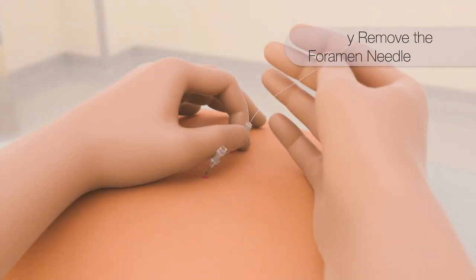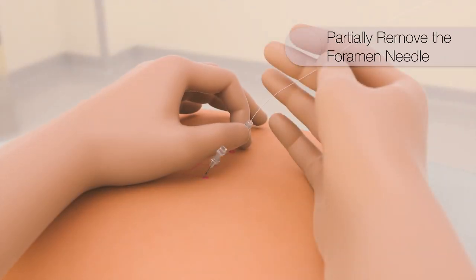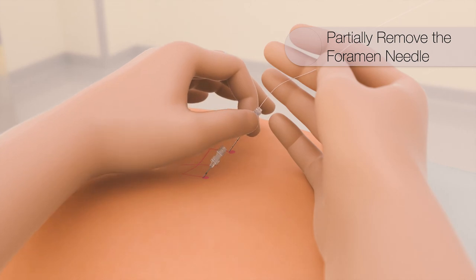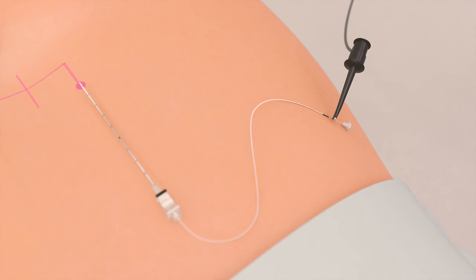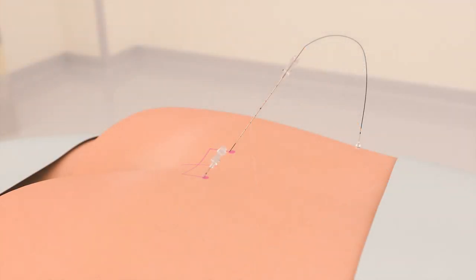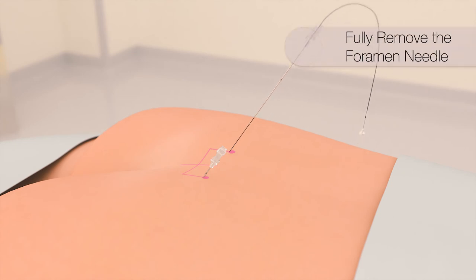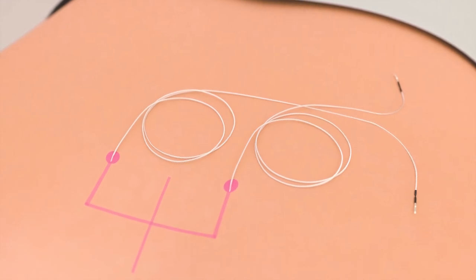The PNE lead is stabilized with one hand while removing the foramen needle from the skin with the other. Before it is fully removed, confirm responses to ensure the PNE lead has not moved. Once responses are confirmed, the foramen needle is fully removed from the PNE lead, removing the lead stylet at the same time. The PNE lead placement process is repeated on the contralateral side.